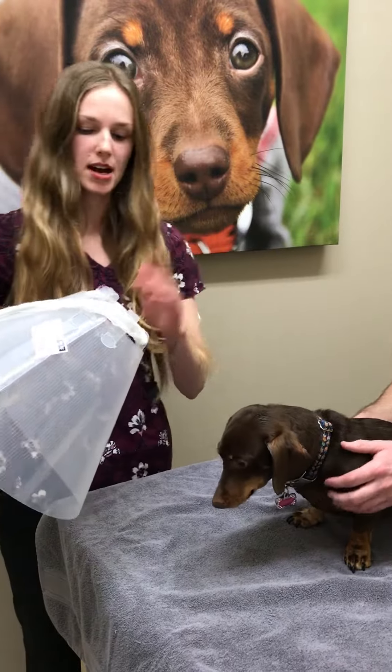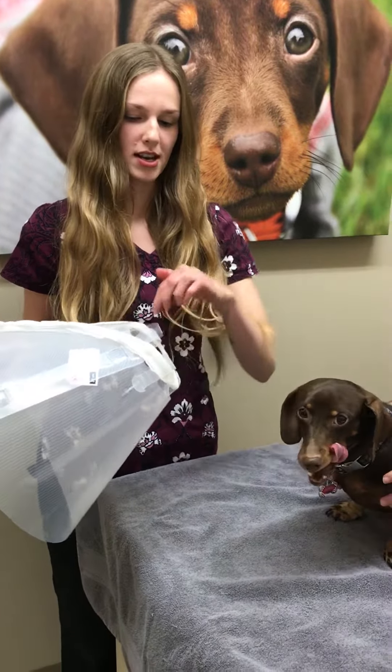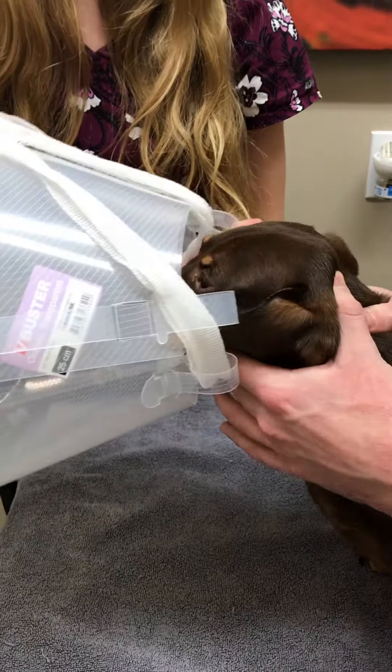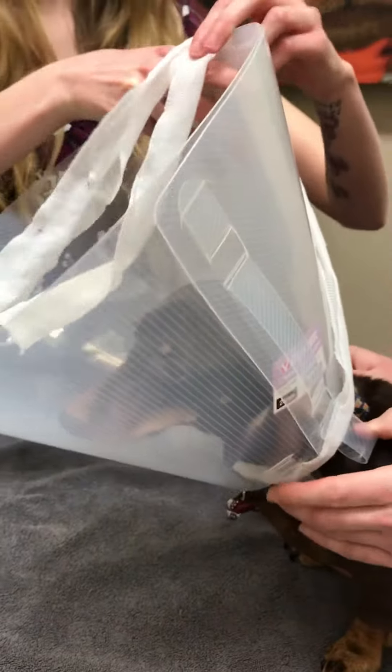So we did need to take it off, and we've got it off here. Now we're going to put it back on. The only way that it goes on, we're going to slip it directly over her head. We want to make sure that we're careful to avoid the eyes, so we're just going to slip it directly onto her head there.